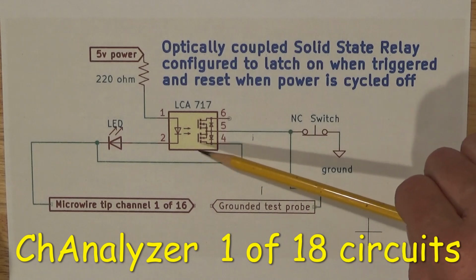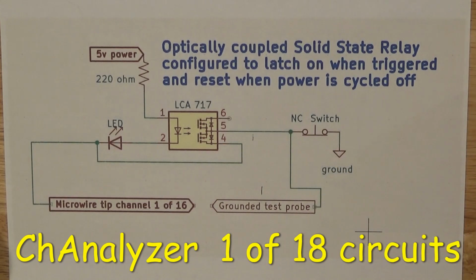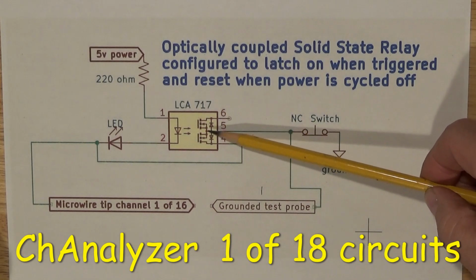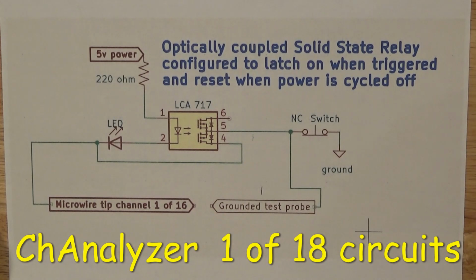And these are 6-pin DIPs, and there's a lot of different devices that will plug in and work. This one's the LCA 717. I've also used the PVA 612s, which I think are now obsolete. But there's quite a few different devices that are designed to work in this application.